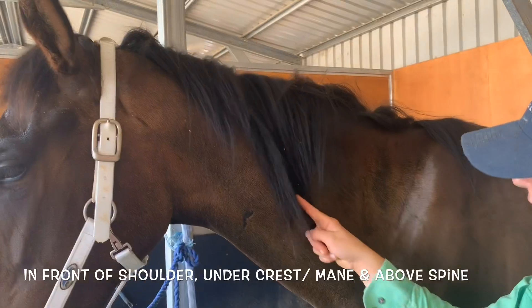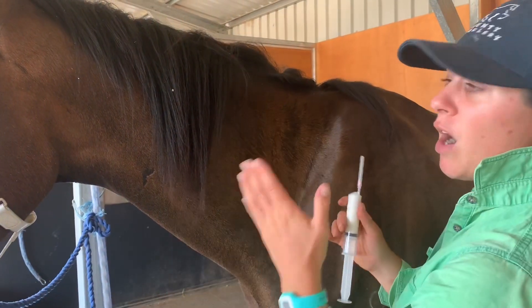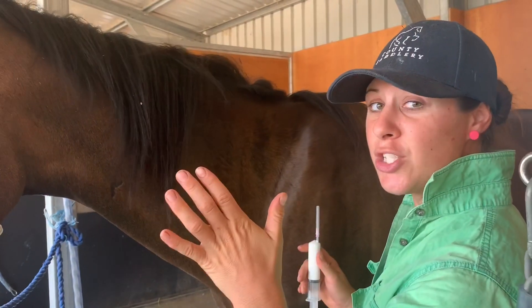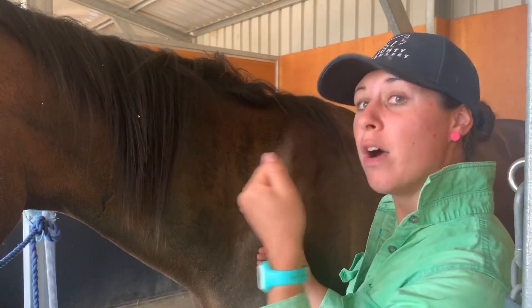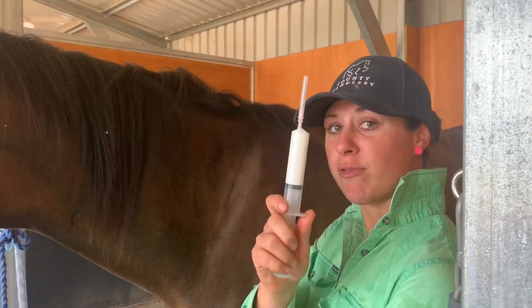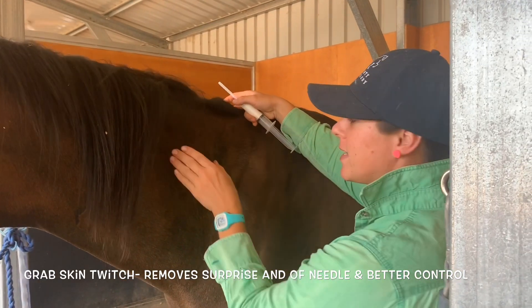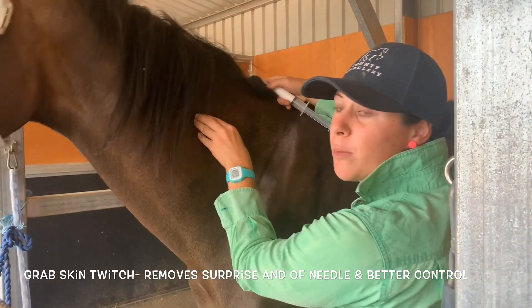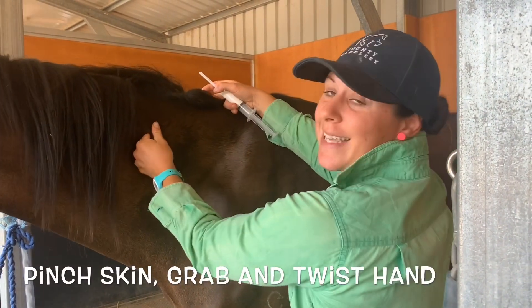The spine runs down like this. Now how I like to do it, I always grab a skin twitch because that way the horse concentrates on your skin twitch rather than the needle. The needle is on the syringe. So first up, I'm going to grab the skin. You have to put quite a lot of pressure on to pick up the skin and then you're going to twist it.